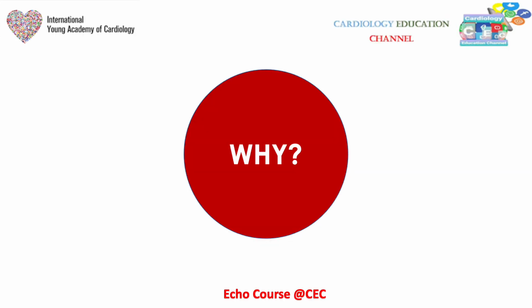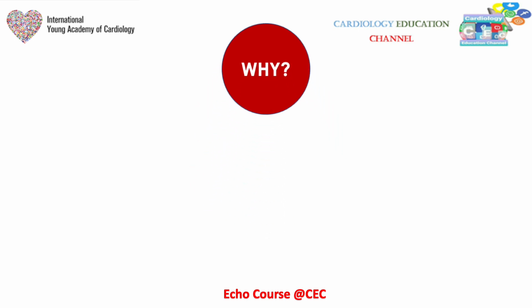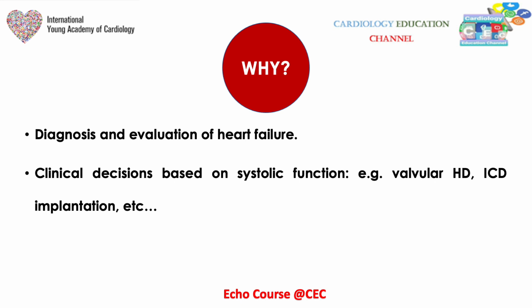So we'll start by asking why we need to assess the left ventricular systolic function. We need it for the diagnosis and evaluation of heart failure. We need it for clinical decisions based on the systolic function, like in a patient with valvular heart disease, or when considering an indication for an ICD. You can see that there are some decisions that are based on the ejection fraction or the systolic function, made on the basis of your echocardiography findings.